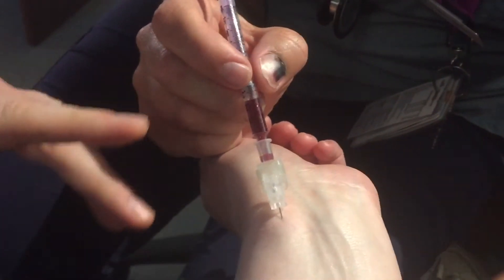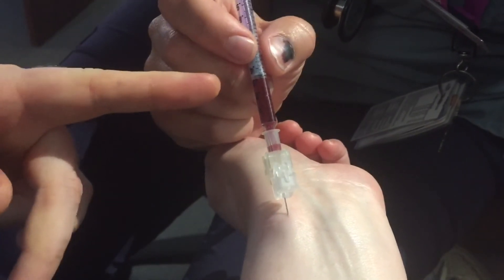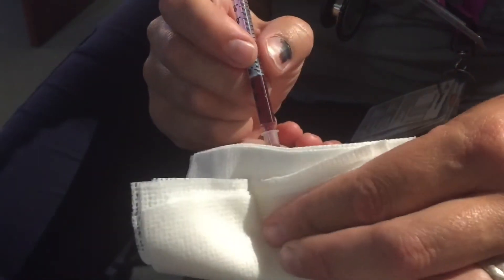So you want to... And it'll pump a bit. Just pull it back a little bit. You want it to fill. There you go. It's still filling. You want it to the top there. Okay. And then pull it out and put some pressure on that.